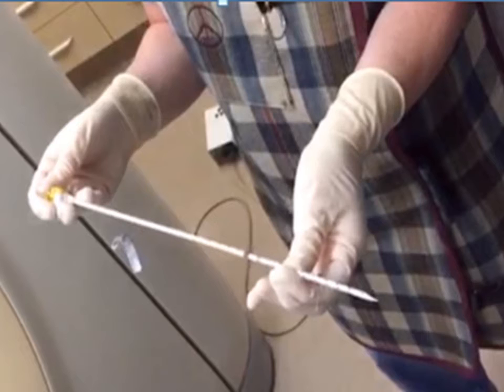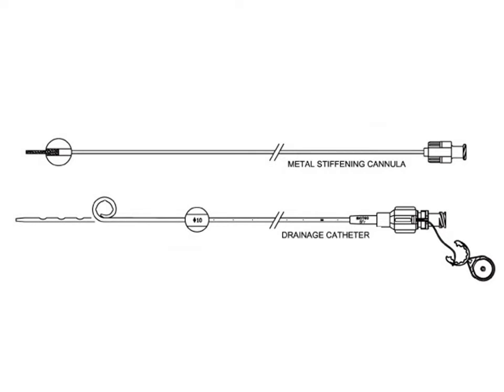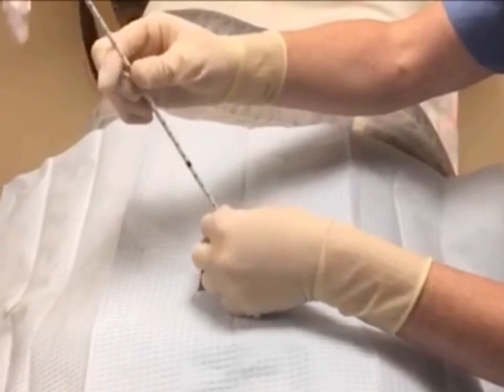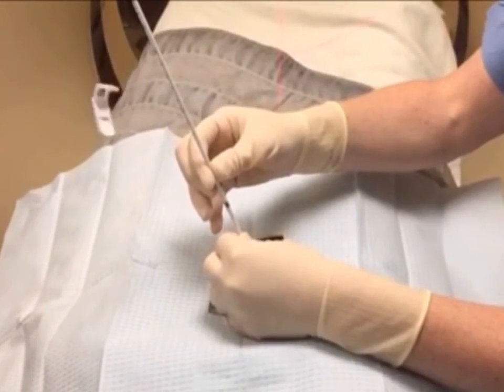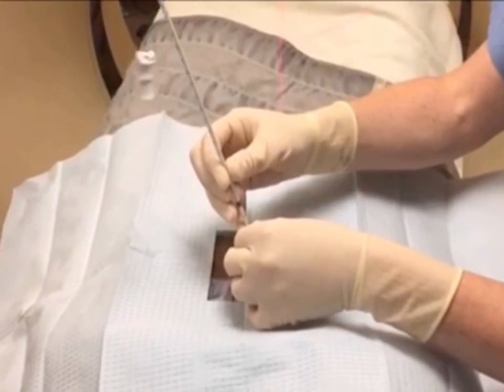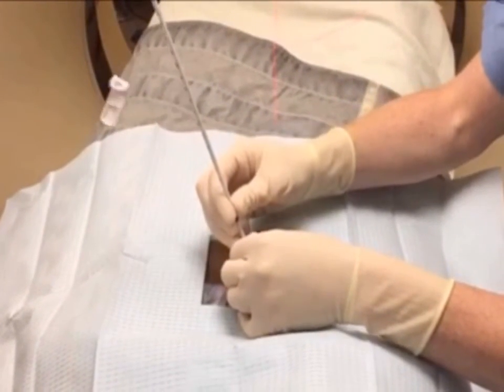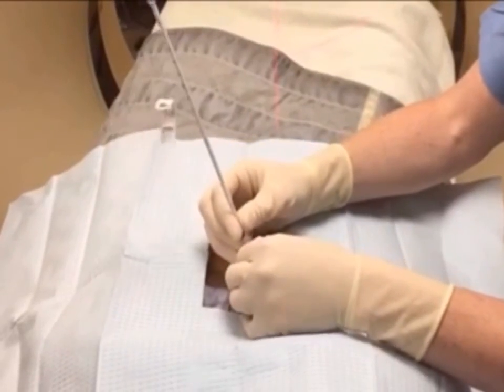For this procedure, a multi-side hole catheter was utilized to drain the abscess. The many openings over the length of the catheter provide better drainage of spread-out fluid collections. Inside the catheter is a metal cannula, which provides rigidity while the catheter is being inserted into the abdominal cavity, but can be removed once the catheter has entered the abscess. Position the catheter at the intended entry spot and line it up at the appropriate angle determined during pre-procedural planning. Slowly inch the catheter into the abdominal cavity. As the catheter pierces the proximal wall of the abscess, there is usually a palpable give suggesting cavity puncture.